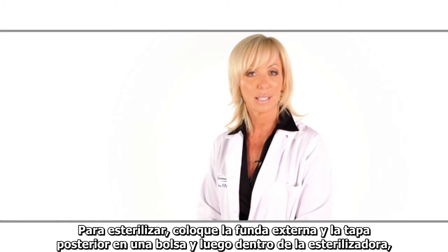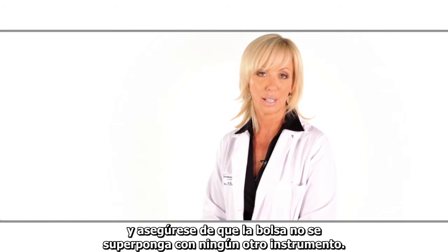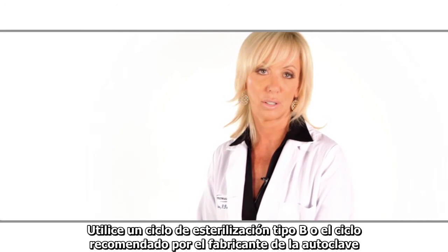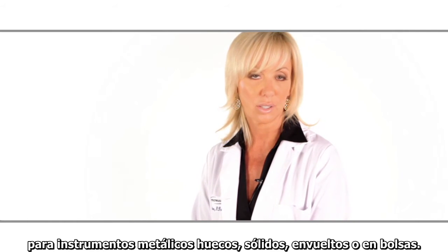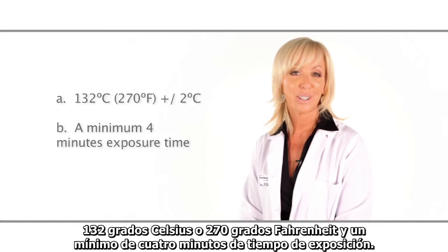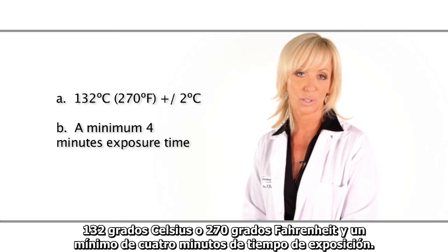To sterilize, place the bagged outer sheath and rear cap in the sterilizer, ensuring that the bag does not overlap with any other instruments. Use a type B sterilization cycle, or the cycle recommended by the autoclave manufacturer for wrapped, bagged, solid or hollow metal instruments. Typical appropriate cycles will have the following attributes: 132 degrees Celsius or 270 degrees Fahrenheit and a minimum of four minutes exposure time.